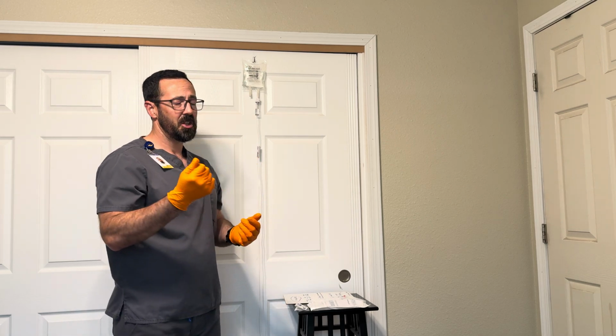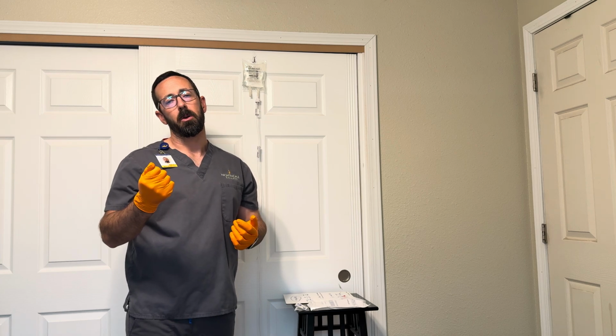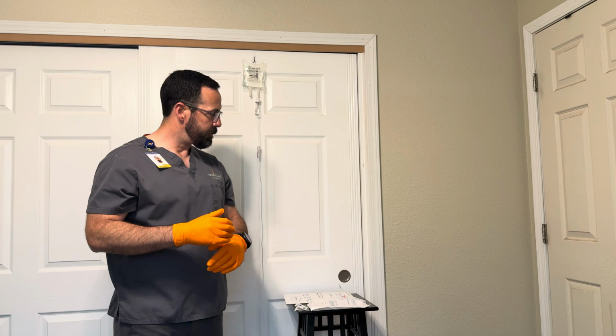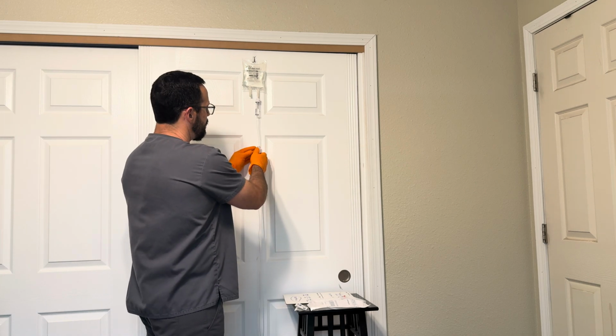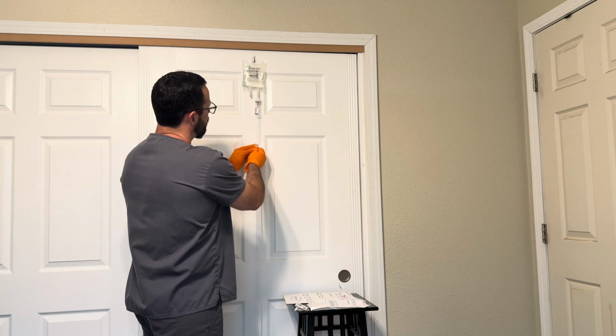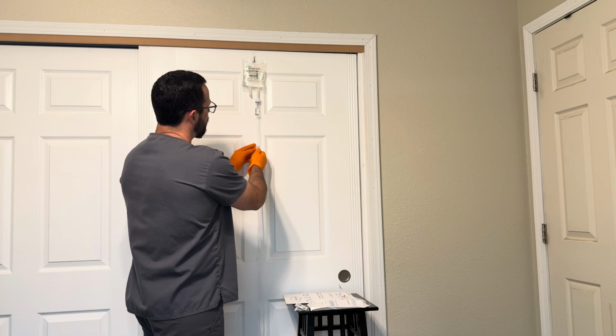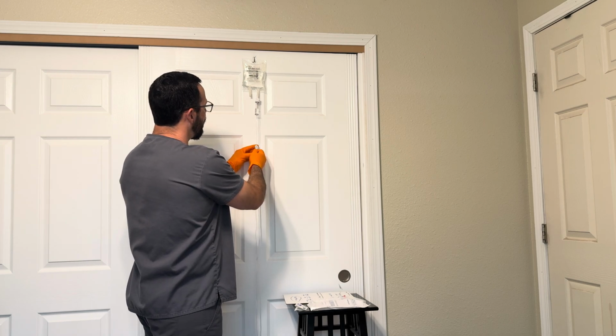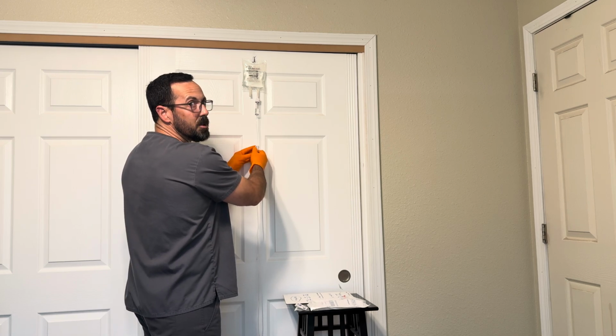I would adjust it just ever so slightly to get it down closer to 38 and recount that minute to do it appropriately. Okay, so assuming that ever so little bit of movement at 38 was too much. I really shouldn't have touched it. I'm kidding.